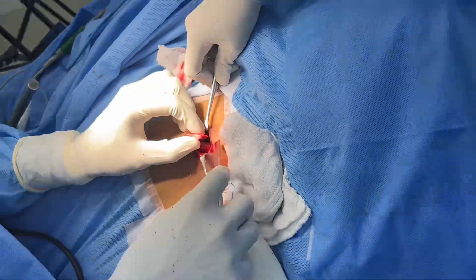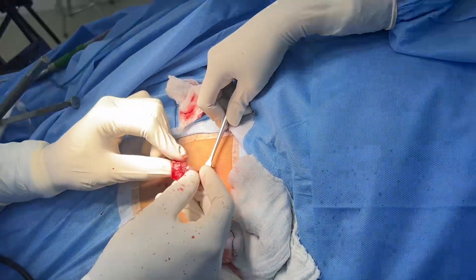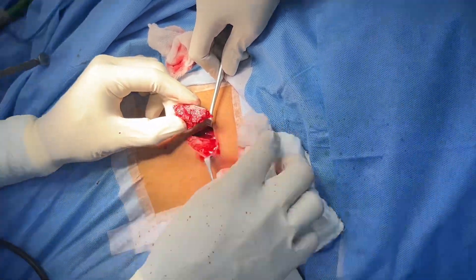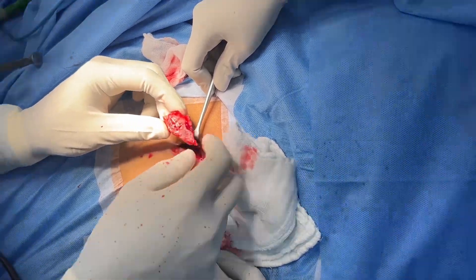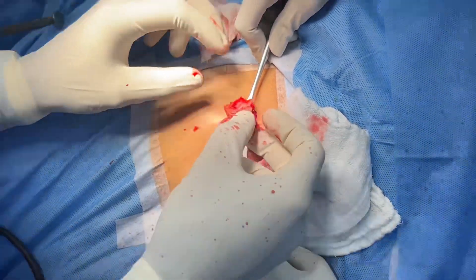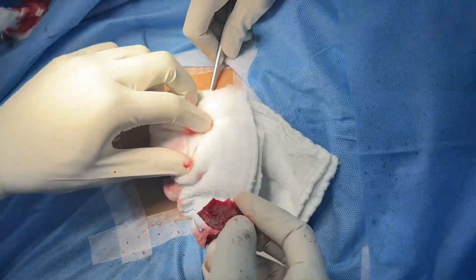You can see I've harvested a huge chunk of this. It doesn't take so long. We can use this because it's a nice cancellous bone — it's got a lot of good cells. This is just the piece we can use for fixing. We're going to let this be now and see if this is going to suffice, or we can come back and harvest more.